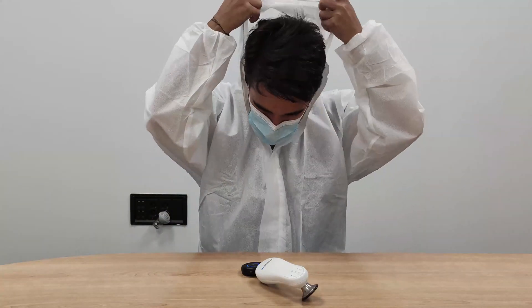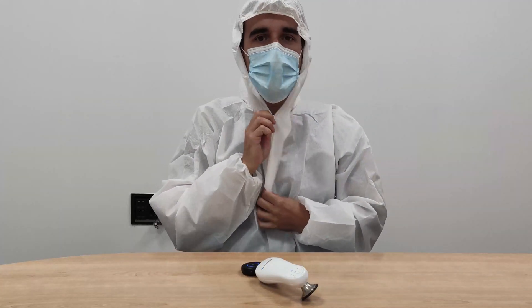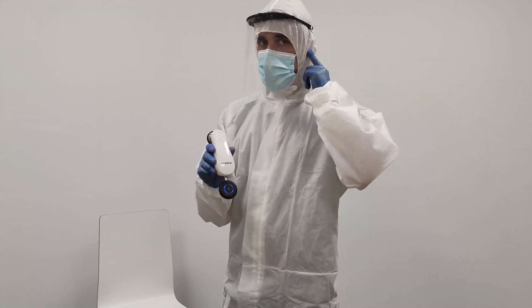With this device, you can prepare yourself before listening to the patient. You will also be isolated from external elements like cables or tubes.